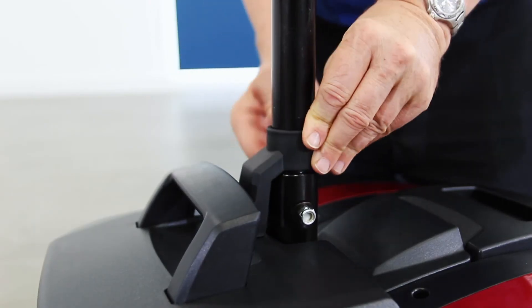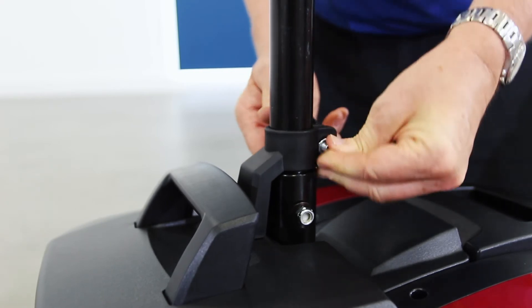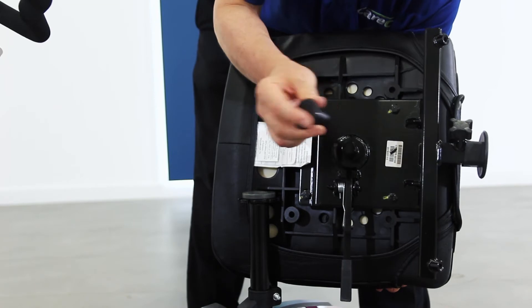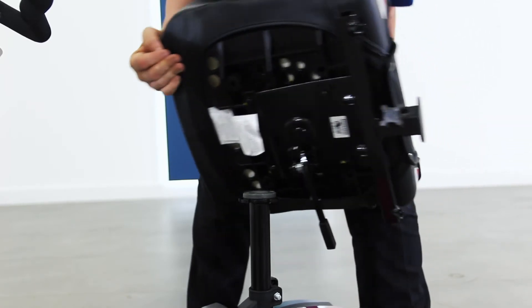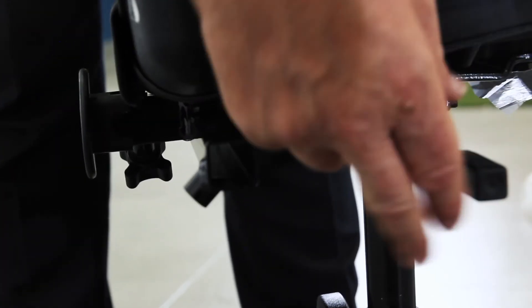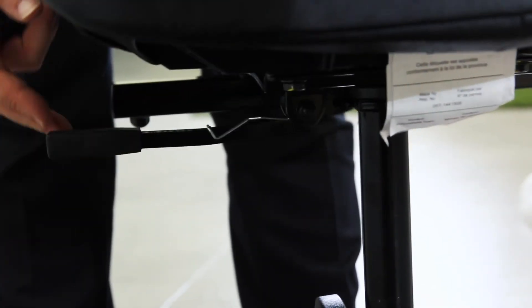Rotate the battery lock and tighten it so that it helps hold the battery in place. Now you can add the seat by simply dropping it in place on top of the seat post. Then use the lever underneath to swivel the chair. This can provide easier access when getting on and off the scooter.